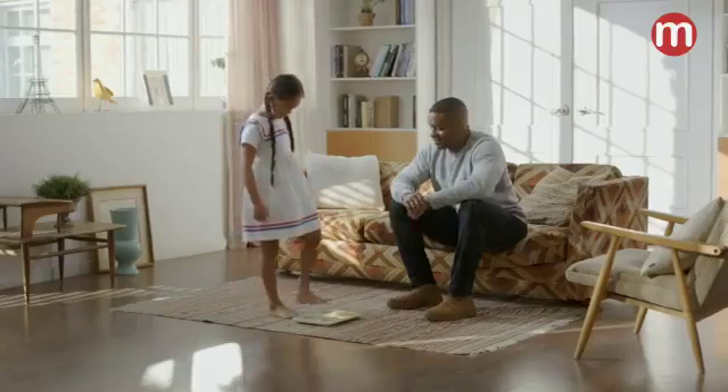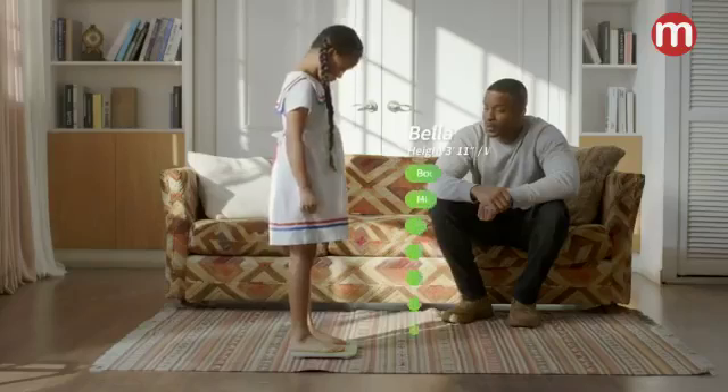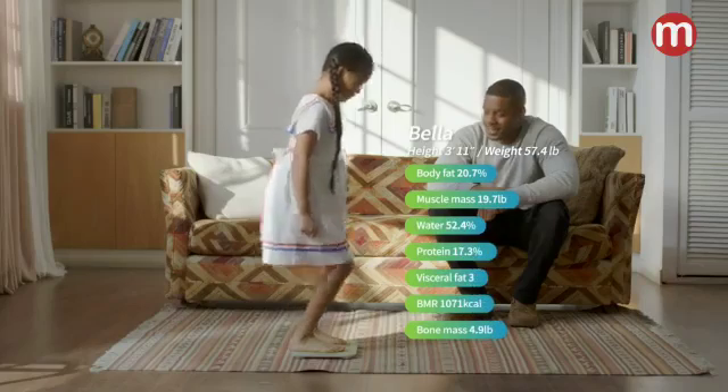Kiko Smart Scale is actually smart. With four electrodes on the plate, you can get weight as well as seven body composition metrics.